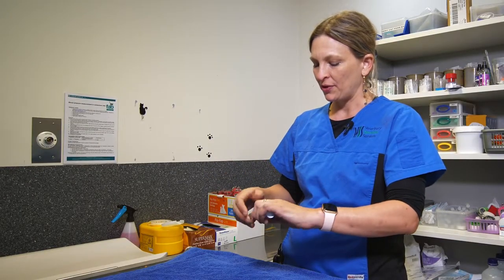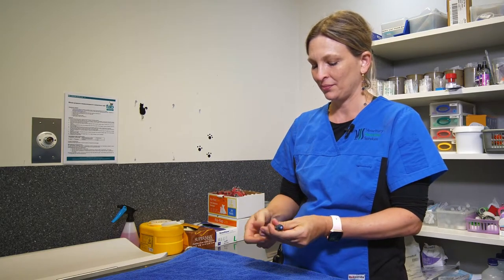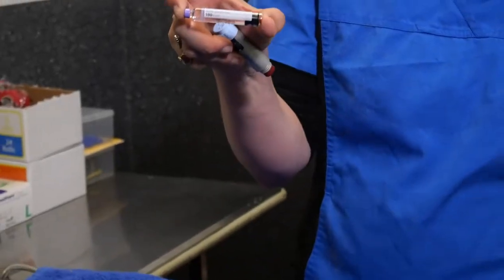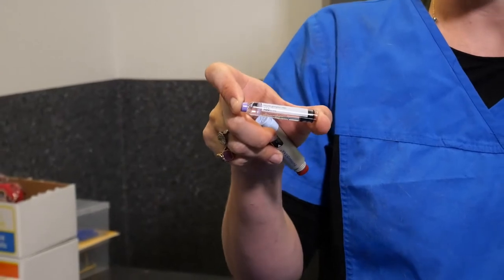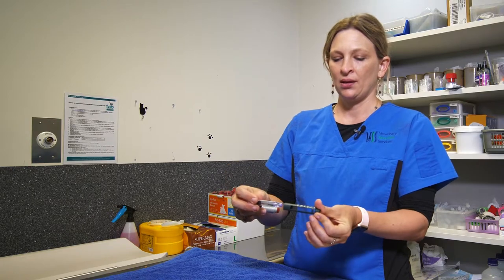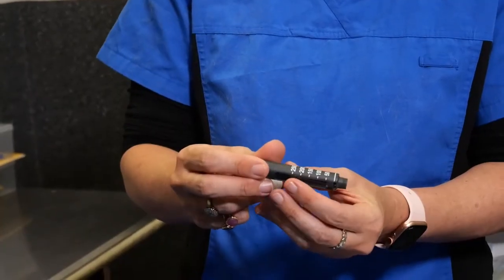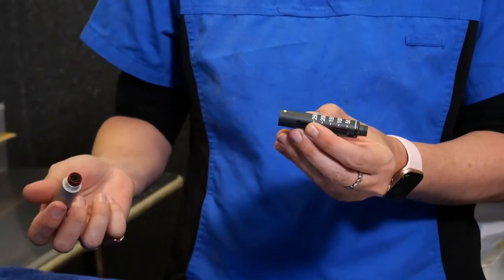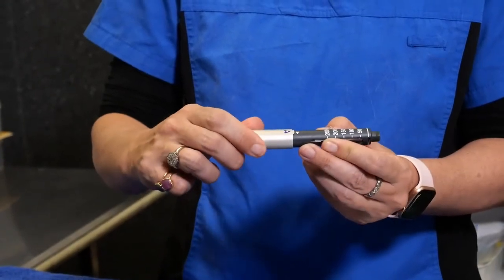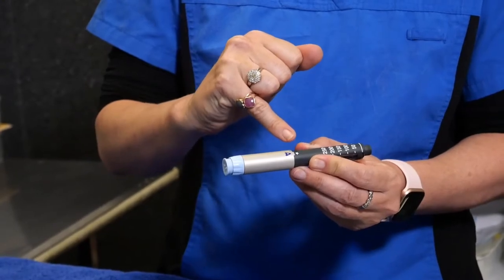When you receive the pen, take the lid off. This pen has been pre-loaded with a cartridge of insulin, but this is what your insulin cartridge will look like. Insert that here — you'll find that the pens come with a very detailed data sheet as well. Screw this in together and make sure that the two stars are aligning.